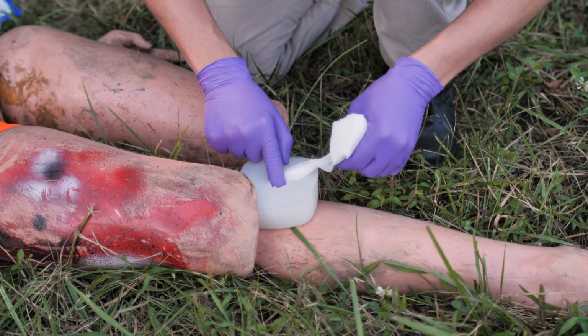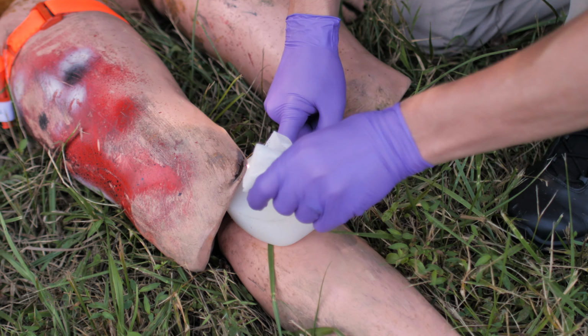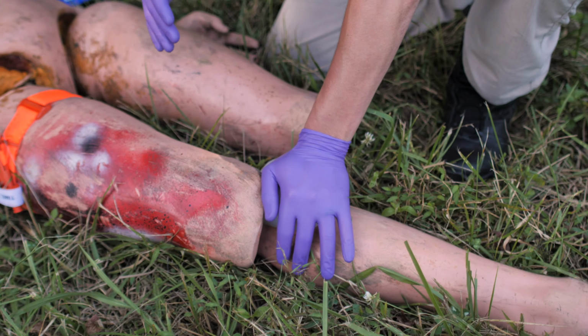We're gonna fill this entire void with the gauze, packing really tightly. Okay, once that's full, I'm gonna take the rest of this gauze, place it on top. I'm gonna hold firm pressure on there. If I have someone else with me, they can hold pressure while I start to do this.